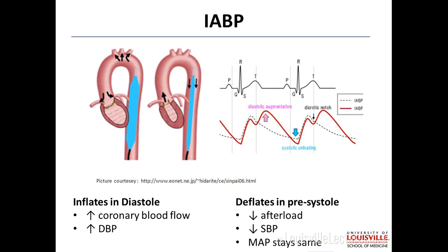If you have AFib and you have a varying RR interval, therefore varying lengths of diastole, the pump can get really confused. So it will be trying and going and stopping and going. So AFib with RVR makes it very difficult for the balloon pump to find where it should inflate. We can sometimes troubleshoot the timing and manipulate it manually. That's above the level of this discussion, but just beware that it might not be doing you that much good if you're in AFib.